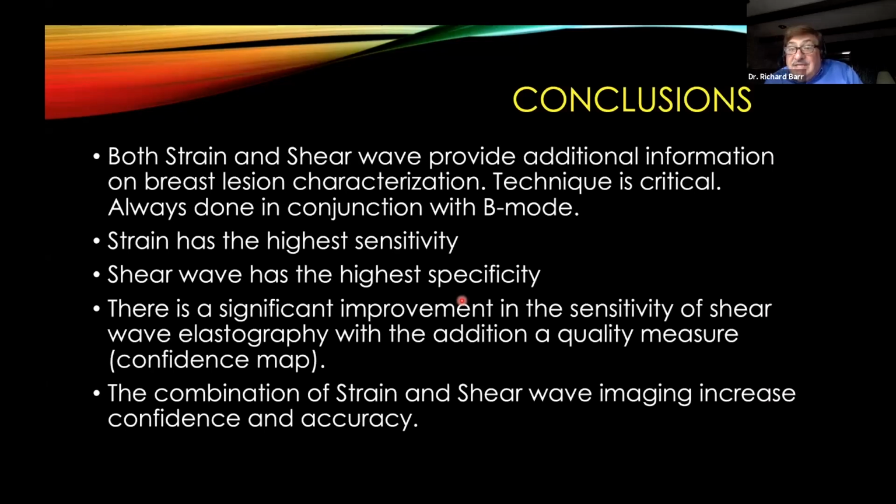So in breast, I cancel biopsies all the time if the shear wave suggests it's benign, but I'm afraid to do that in thyroid because we've had so many soft thyroid cancers. So in thyroid, if the value is high and I'm not so suspicious, I would still do an extra biopsy. So in thyroid, I tend to do more biopsies because of shear wave. In breast, I do less.